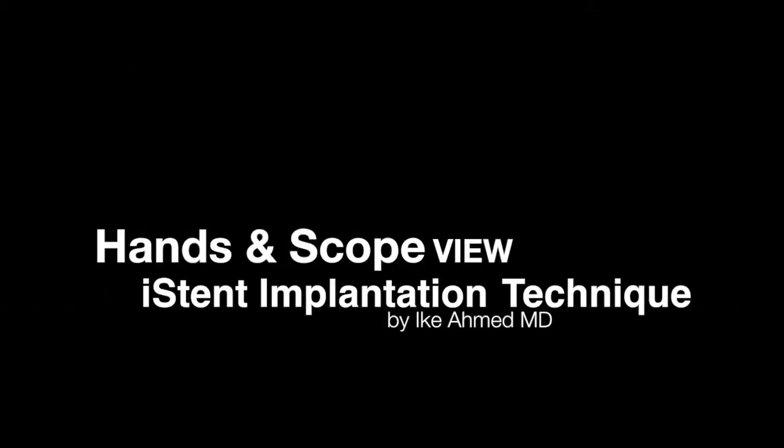This video will describe pearls of iStent implantation, specifically with the left-pointing iStent and the right-pointing iStent, by using a variation on hand grip on the applicator — namely a forehand and a backhand grip — as well as differentiating counterclockwise versus clockwise rotation.